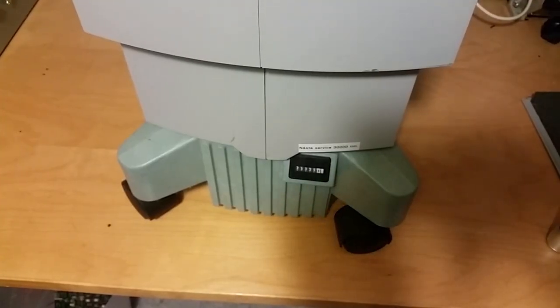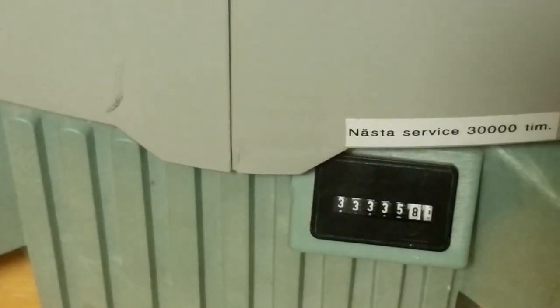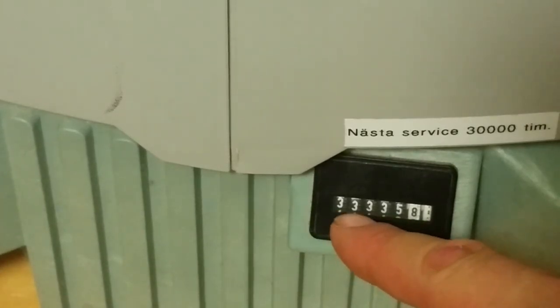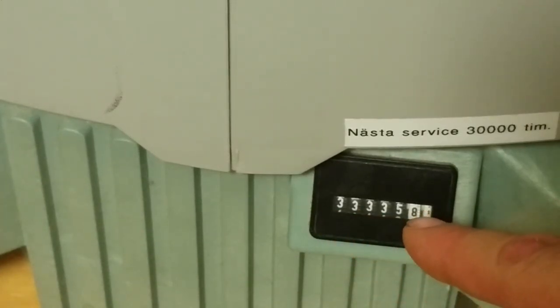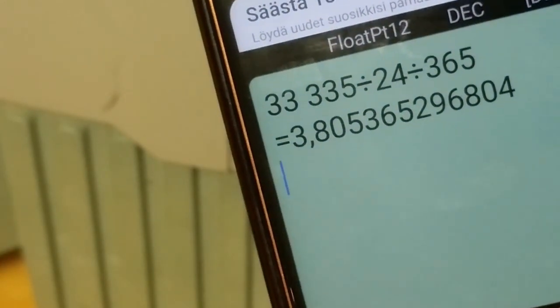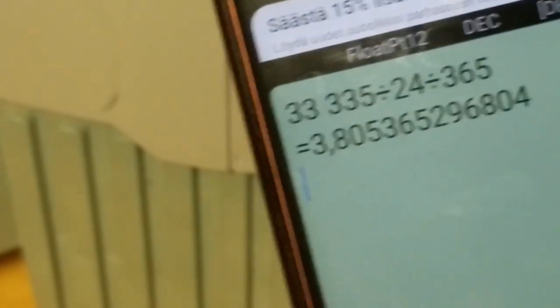Before we take it apart, let's see how long this unit has been turned on. Unbelievable — look at the hours: 33,000 hours, a little bit more. So it sounds like a lot, but actually it has just been turned on for about 4 years continuously.